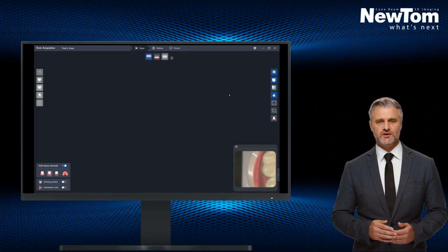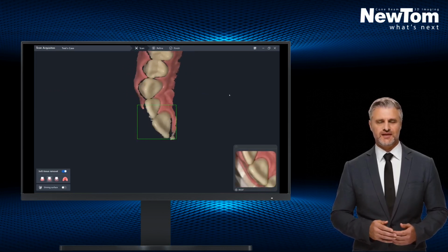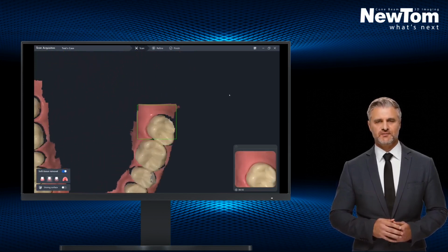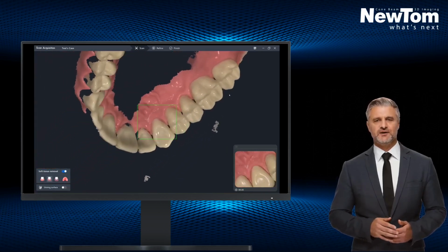We activate the recording with the Start button and perform the acquisition of the entire occlusal area, making zigzag movements that will allow acquisition of the occlusal part and vestibulolingual references. This will help to have a precise and defect-free model.